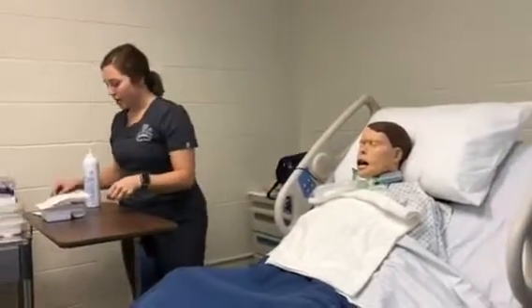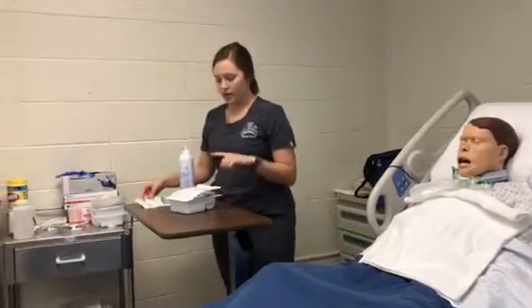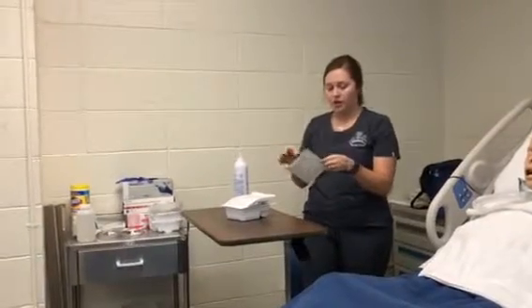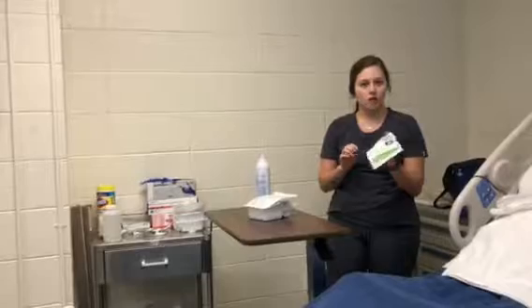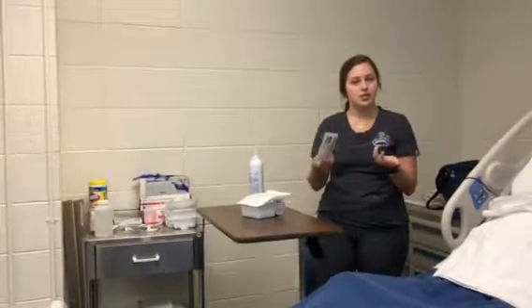Okay. And now I am going to open my tracheostomy kit. And this is what we're going to use to clean. Before I get in there and I'm sterile, I'm just going to go ahead and open this. This is the gauze that we're going to put on after we clean. This doesn't necessarily have to be sterile. We just like to keep it clean.